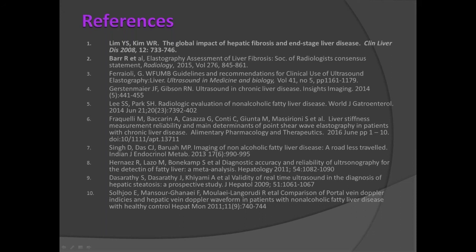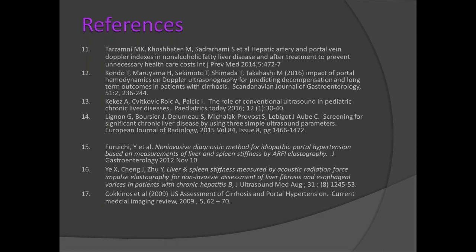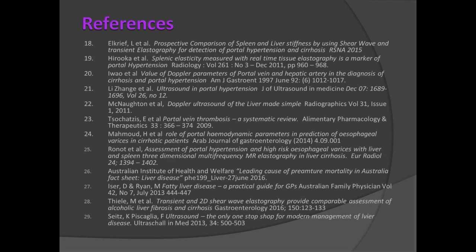So, Claire, I've just got one question from Amanda. It says, we aren't getting history. How do we report this? So is that in terms of what their presenting disease process is? That may be something that you might need to request from the referrers.